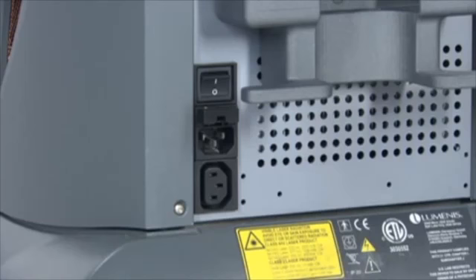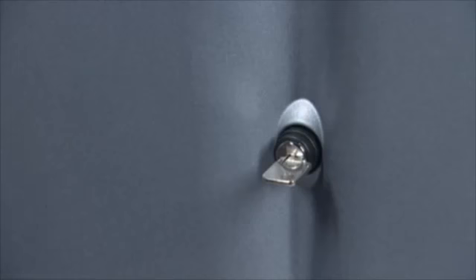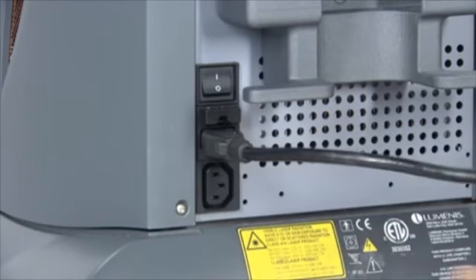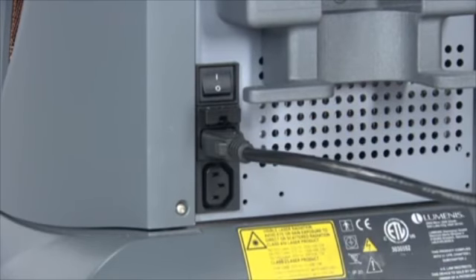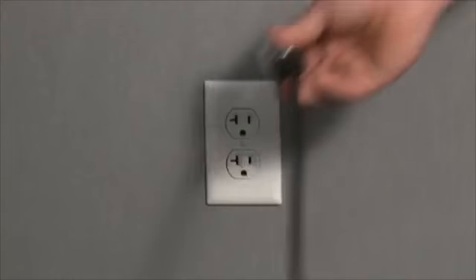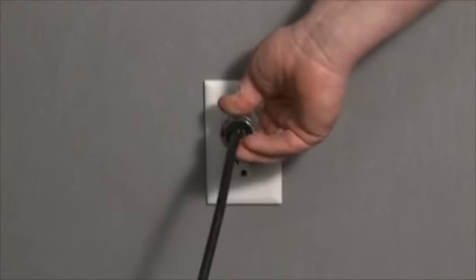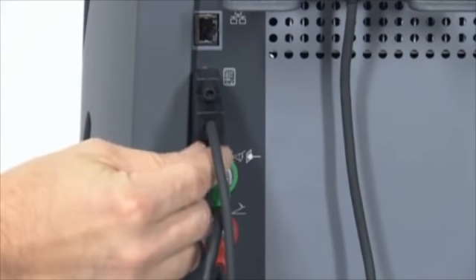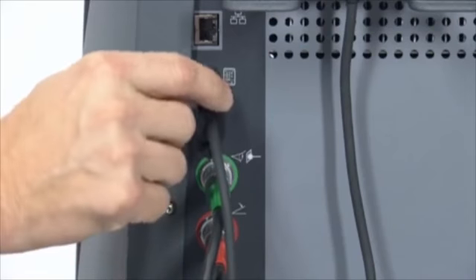The main power cable will vary in appearance according to the electrical requirements of the country in which the laser will operate. First, ensure that the key switch is in the off position. Next, insert the matching end of the main power cable into the main power receptacle on the rear of the laser console. Finally, insert the main power plug into the wall socket. You may connect the remote control at any time by inserting the remote control plug into the remote control receptacle on the rear of the laser console. Secure it with the thumb screws.